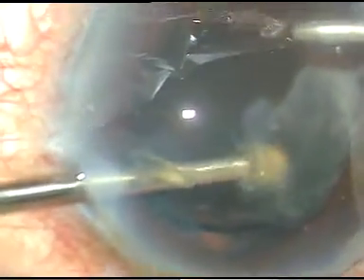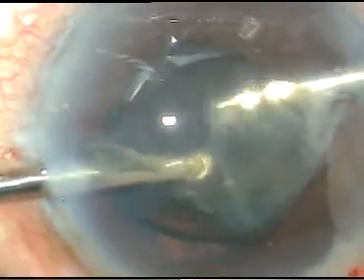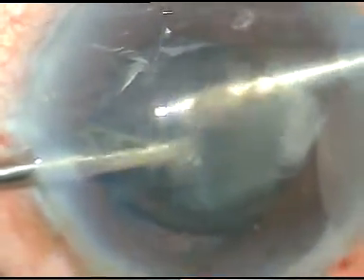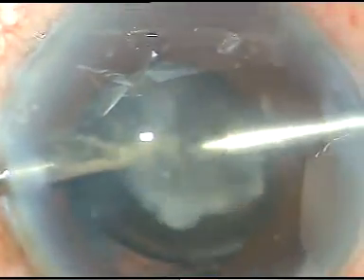Yes, it is coming easily. I am just feeding the epinuclear material into the cutting port, and it is removing the epinuclear material nicely.